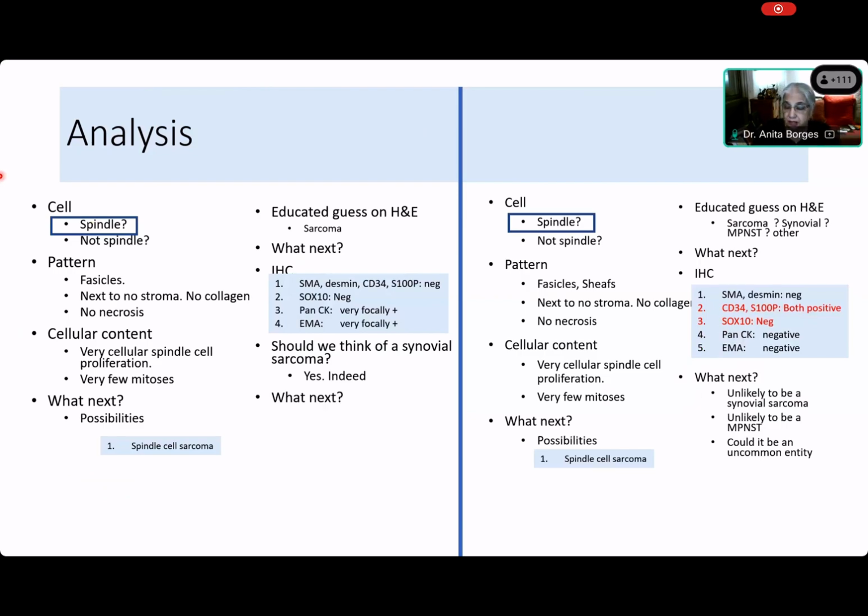Now on this side, I think it is a synovial sarcoma, so what should we do to prove it? What should we do? Additional immunohistochemistry, ma'am. Yes, somebody in the chat box says, could it be an angiosarcoma? All right, we will discuss that in the questions. So we have to do immunohistochemistry. Yes, and the common immunohistochemistry that we do for synovial sarcoma is TLE1, CD99, which is MIC2, BCL2, calponin.